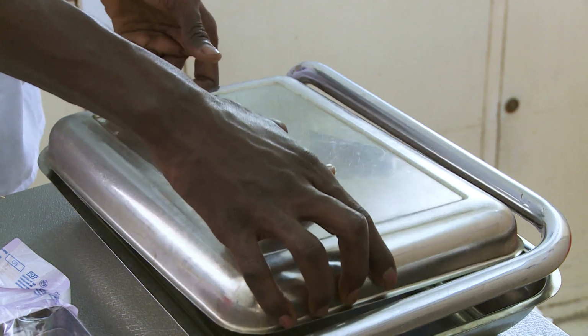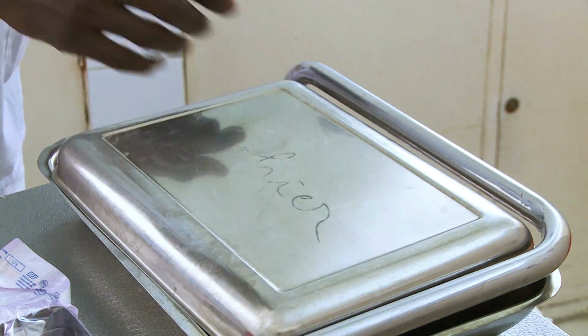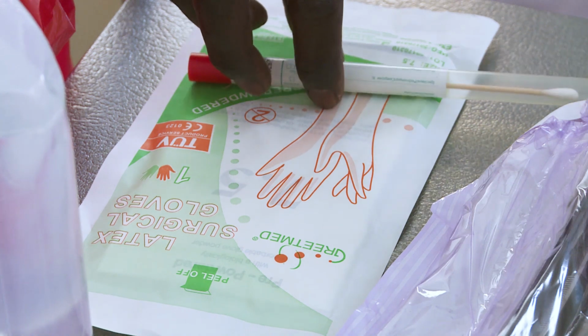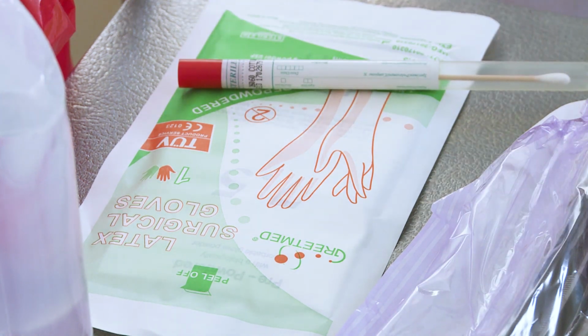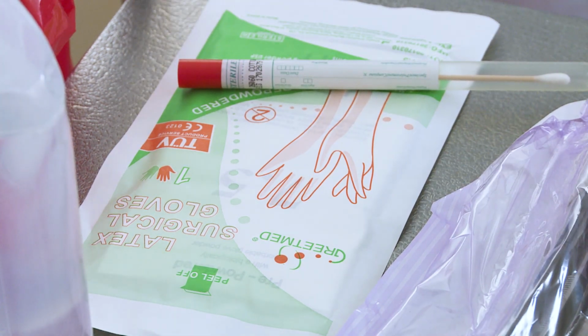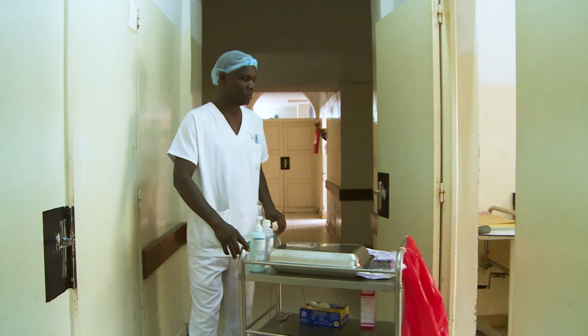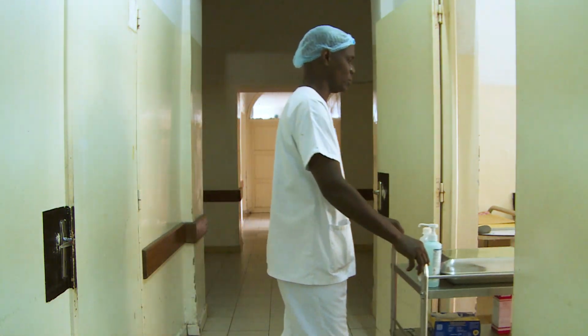Place a sterile tray or cover over the top of the sterile field. If specimen collection is anticipated, a specimen collection bottle or pot and specimen swab should be included on the trolley. Once this material has been gathered, proceed to the patient's room.